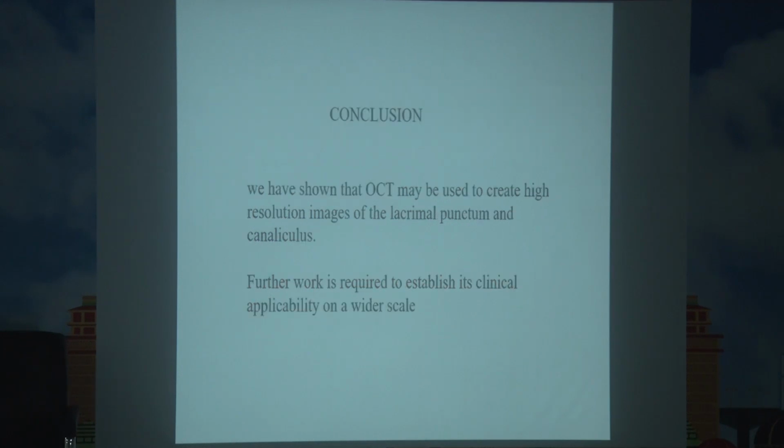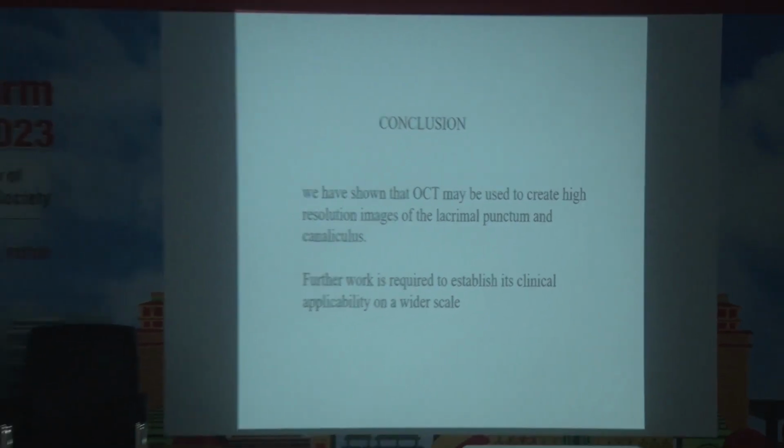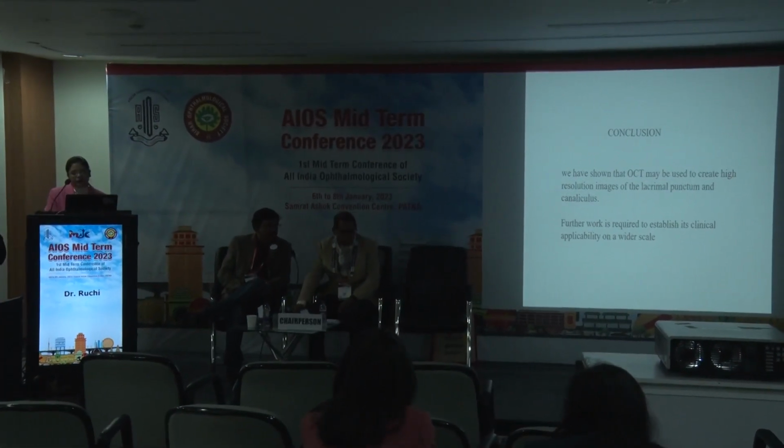We can conclude that we have shown that OCT may be used to create a high-resolution image of the lacrimal punctum and canaliculus. Further work is required to establish its clinical applicability on a wider scale.